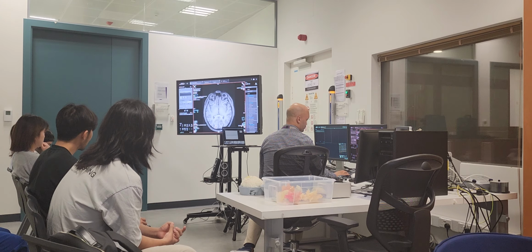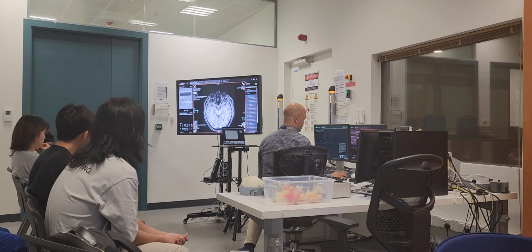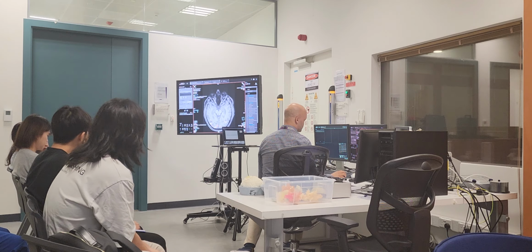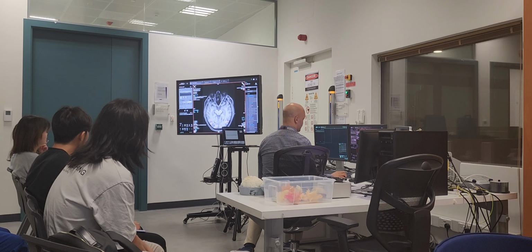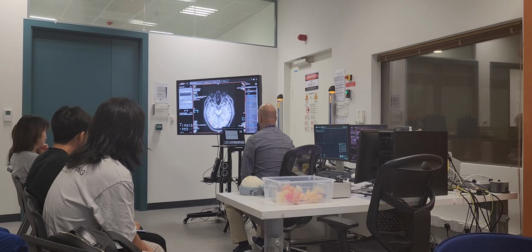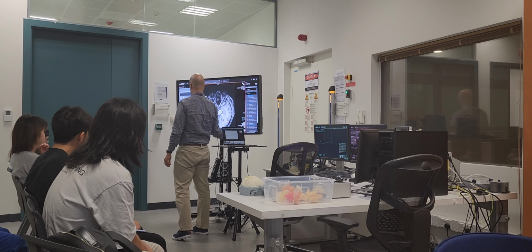Let's find the visual pathway fibers. It's these. So these are the optic radiation fibers coming here, and you see this is visual activation. This is like the visual activation task. So you see that the optic radiation is terminating in the visual cortex. Okay, so I have 5 more minutes, and then I'll let you go.